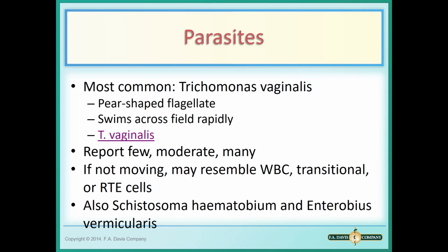Other ones, we can see Schistosoma haematobium. This is not a common parasite in the United States that we typically see in urine.